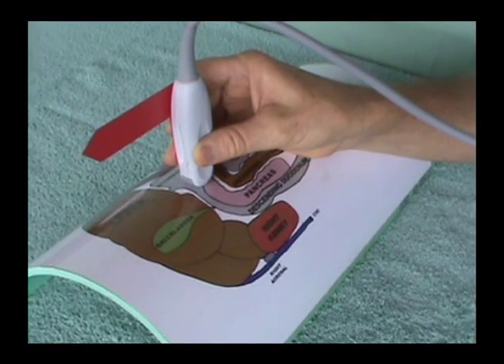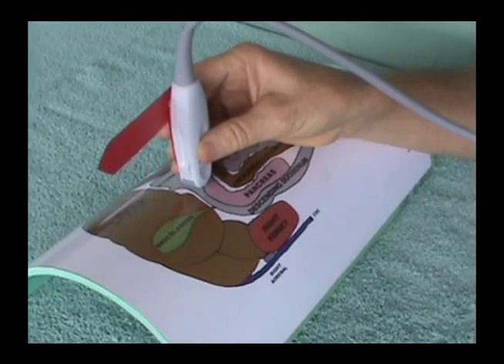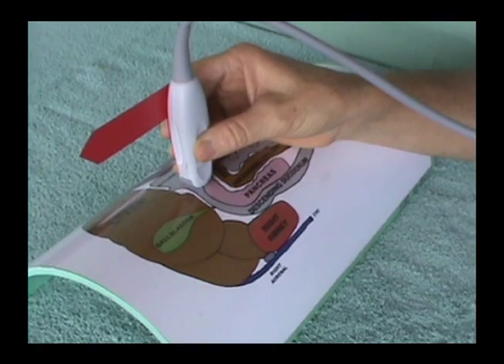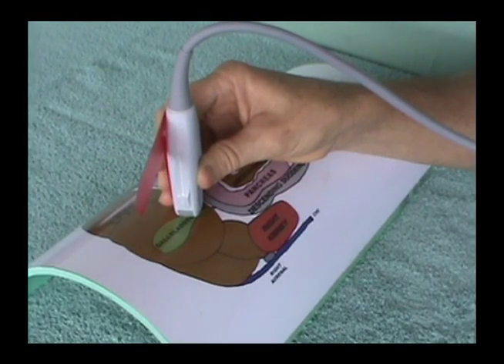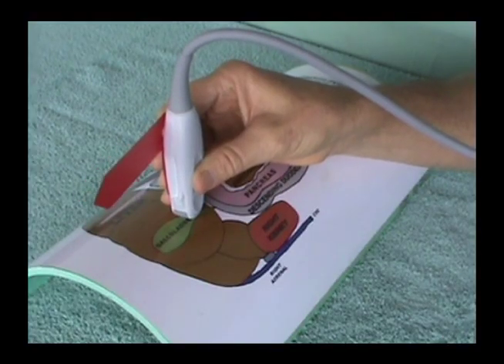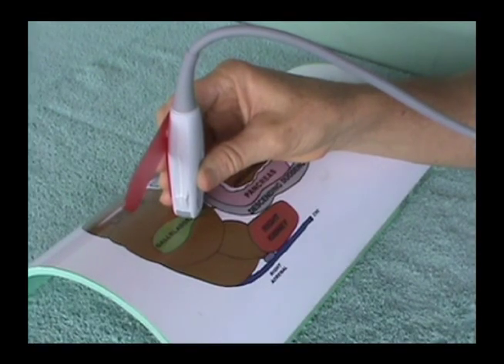Rotation is a circular movement of the transducer from a point of fixation. Most commonly, rotation is from a sagittal to a transverse plane and back to sagittal. Sometimes you must rotate just enough off sagittal to line up the ultrasound beam with an organ being imaged. Try not to combine forms of transducer movement, like sliding and fanning at the same time.